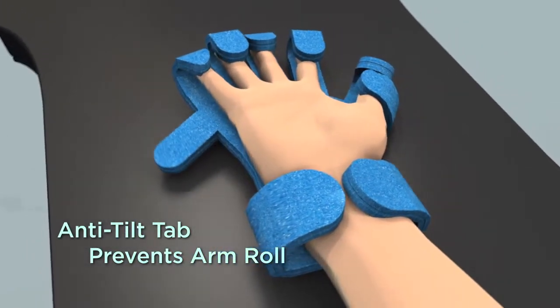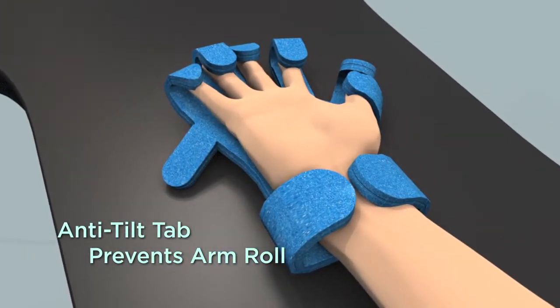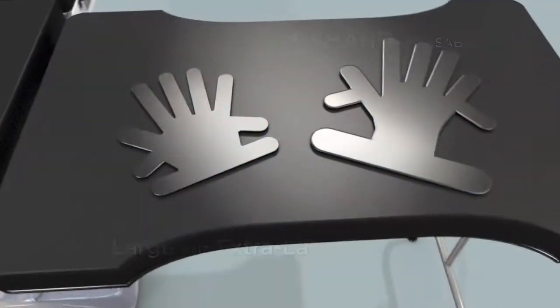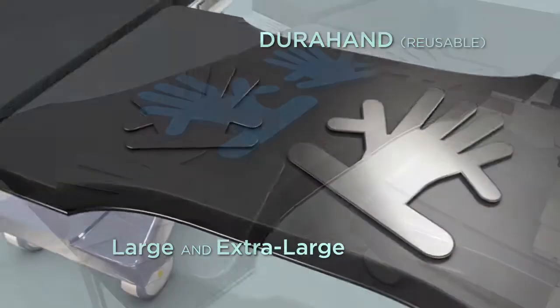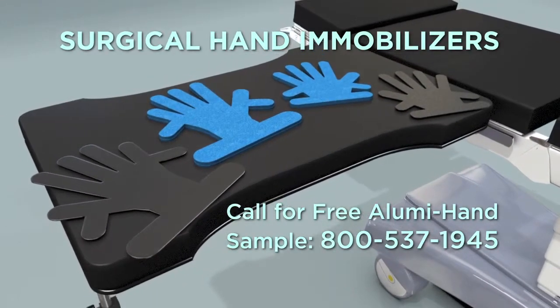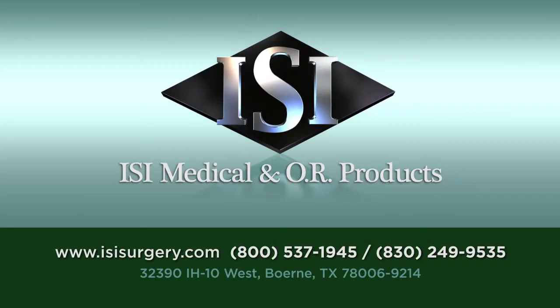The anti-tilt tab creates a kickstand to prevent rotation of the arm. Available in two sizes. The DuraHand is reusable and is now available in three sizes, including pediatric. For lead-free and latex-free hand positioning, call ISI today.